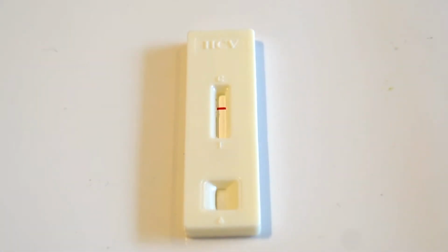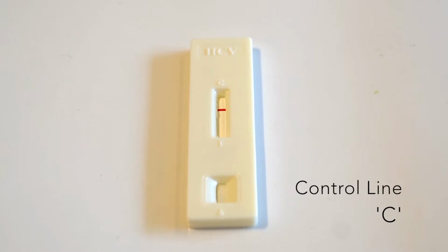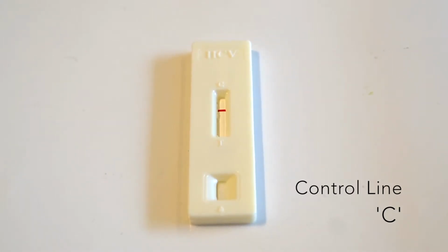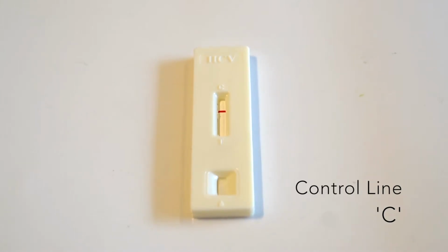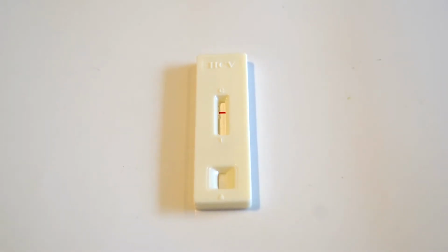To read the test results, a control line should appear in the area marked with a C on the cassette. This indicates the test has run successfully and should appear in the event of either a reactive or non-reactive test. If the control line does not appear, the test has not been successful. In this event, the test should be repeated using a new cassette and sample.